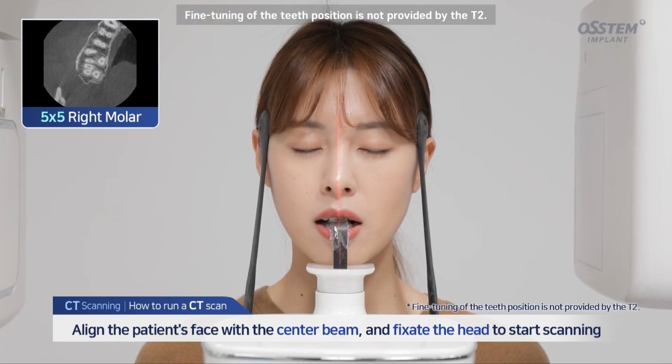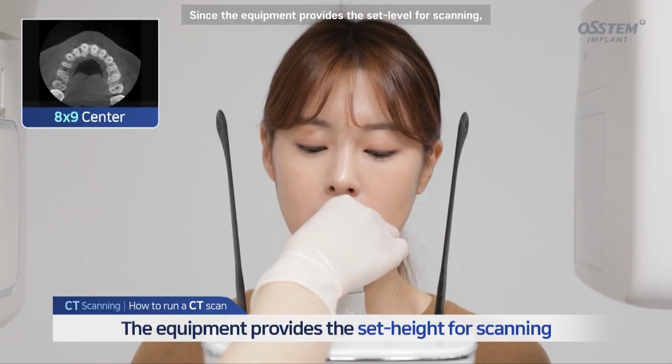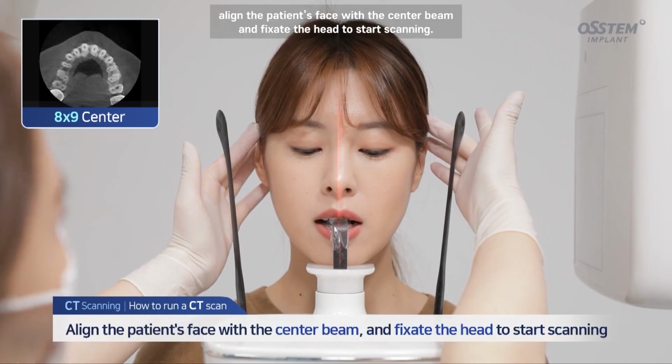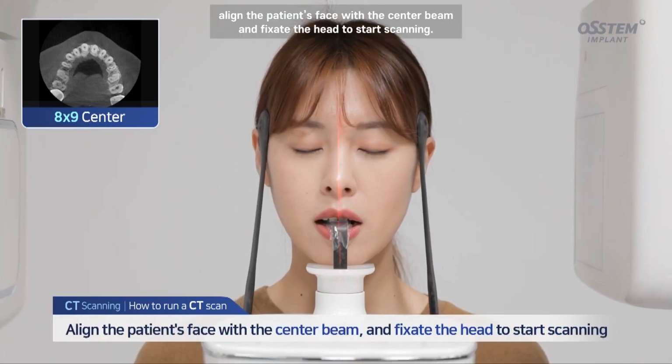Fine-tuning of the teeth position is not provided by the T2. For an 8x9 scan, you can choose one of 3 areas from the maxillary and the mandible for scanning, since the equipment provides the set level for scanning. Align the patient's face with the center beam, and fixate the head to start scanning.